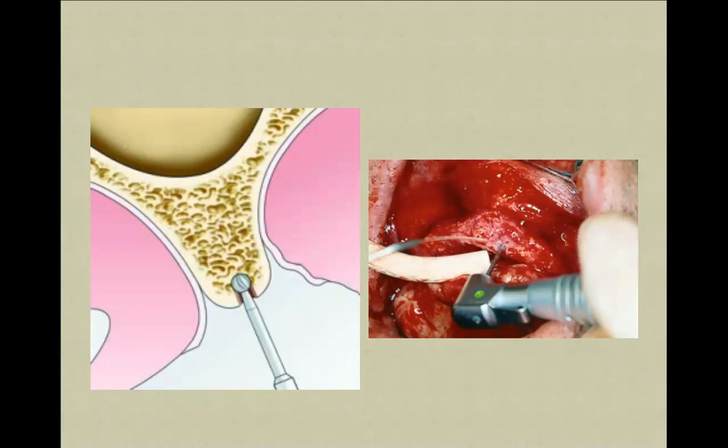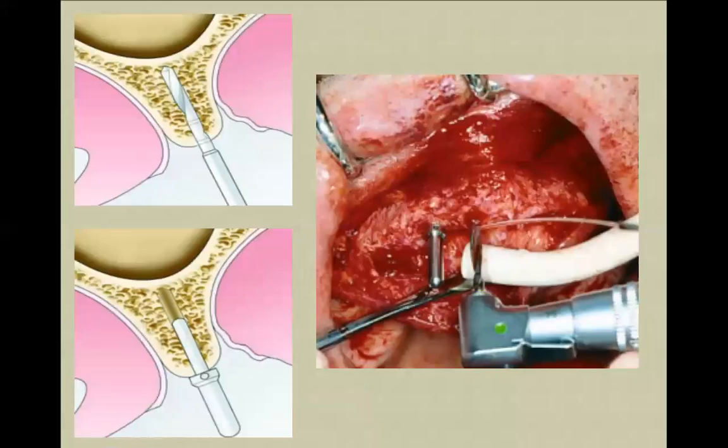That is very important, because if you place an implant and there is not enough bone in between implants or in between implant and tooth, there will be no osseointegration and the implant might be lost.